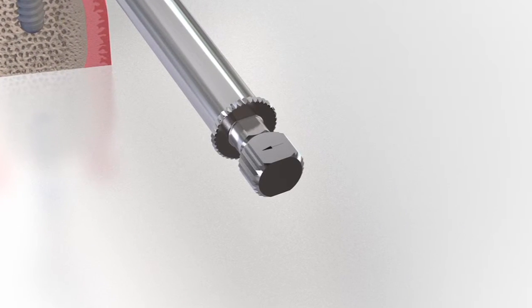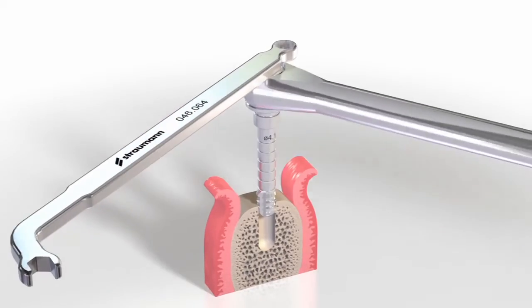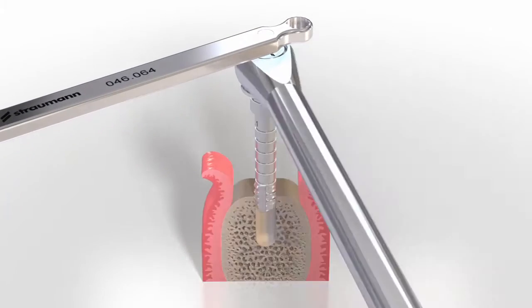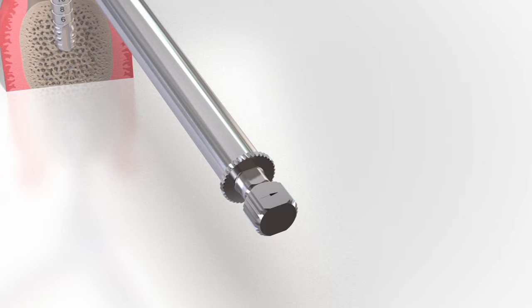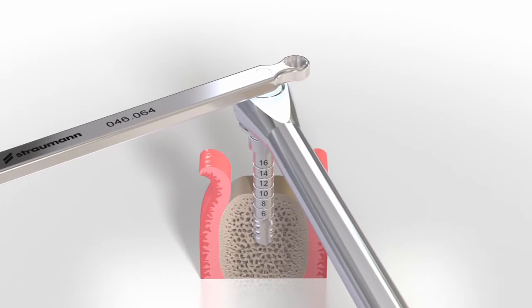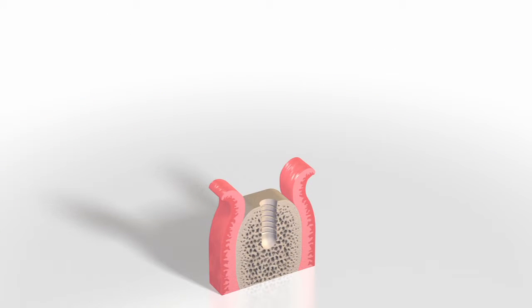The clockwise arrow on the knob indicates the direction of insertion. The thread is tapped with a slow, rotating movement. The direction of the ratchet is changed so that the arrow on the knob points counterclockwise. The holding key functions as a stabilizer to maintain the direction of tapping.